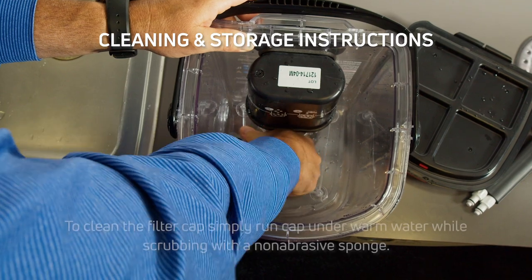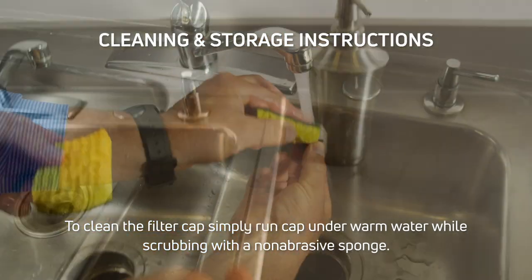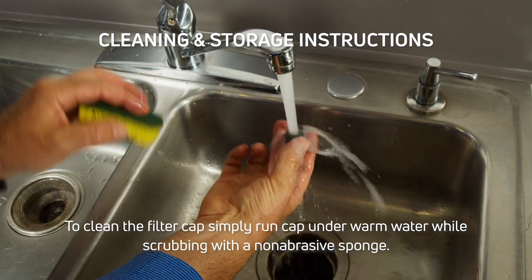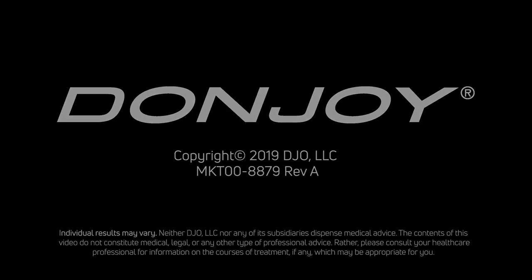To clean the filter cap, simply run the cap under warm water while scrubbing with a non-abrasive sponge.